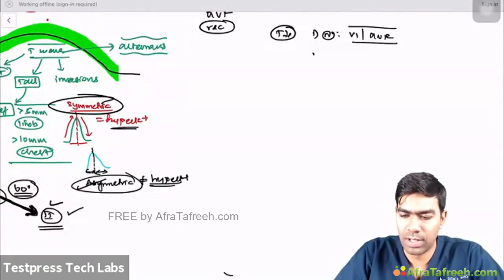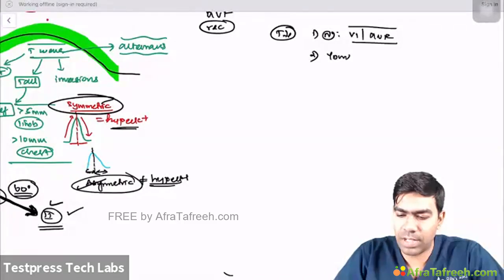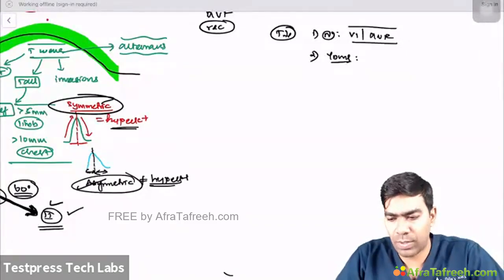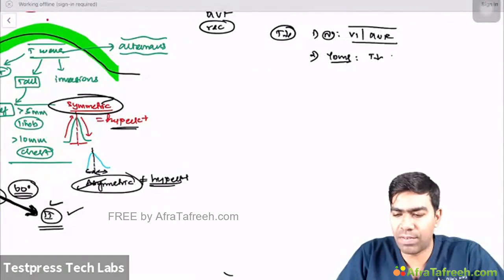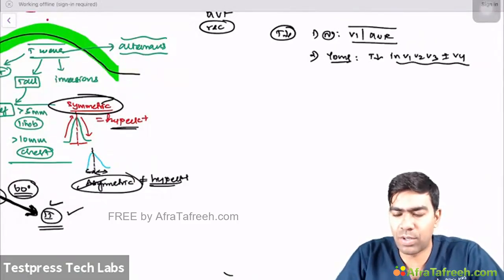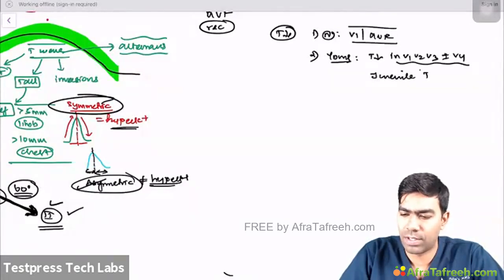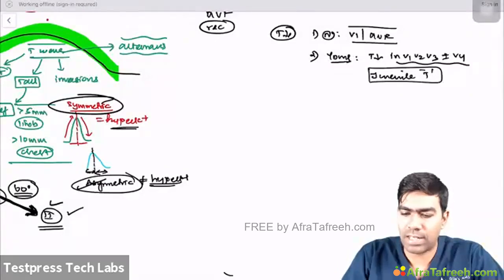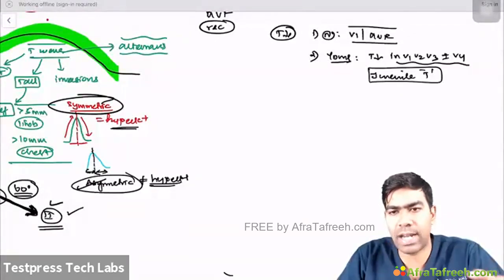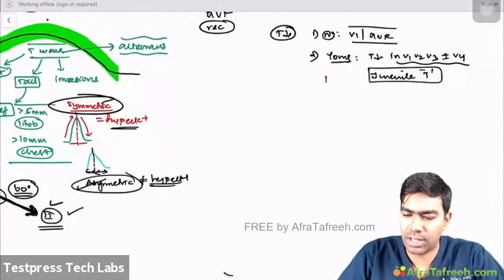to be abnormal. And second, in young individuals, especially in pediatric children, there can be benign T wave inversions in V1, V2, and V3 sometimes, maybe plus or minus V4. So these leads can show T wave inversion. This is what we refer to as juvenile T waves. And sometimes these T wave inversions can be carried into adulthood also, especially in females. That is called persistent juvenile T wave pattern.